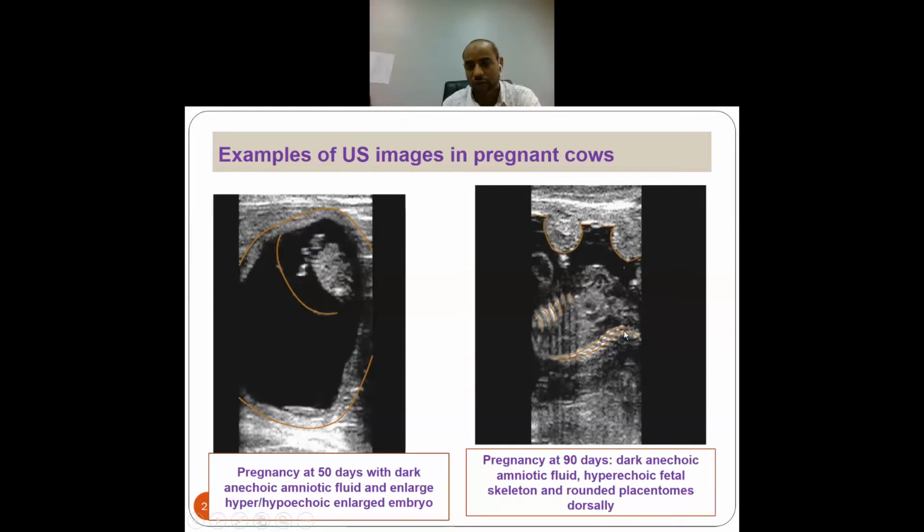You have got here the vertebral column, all right? And these are the thoracic ribs, or the rib cages, the area of ribs. So this is like the head region of the fetus.